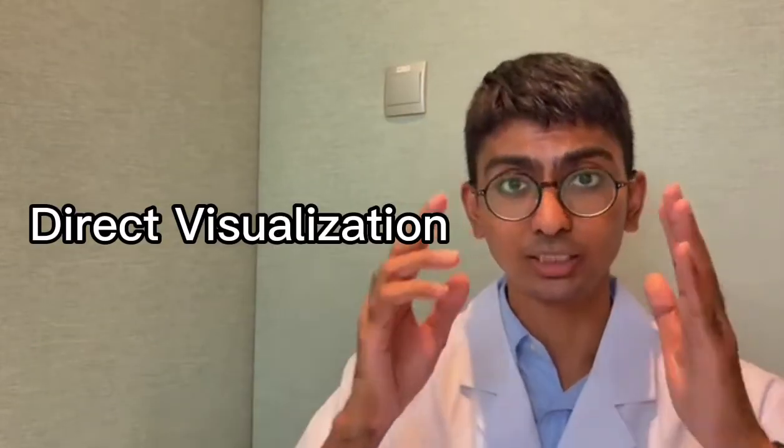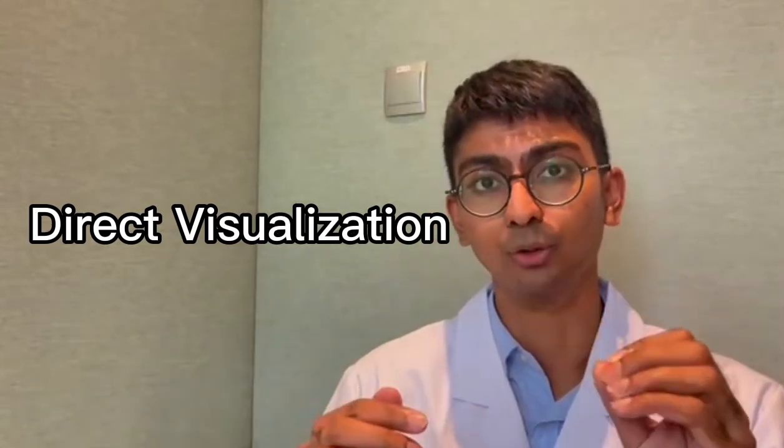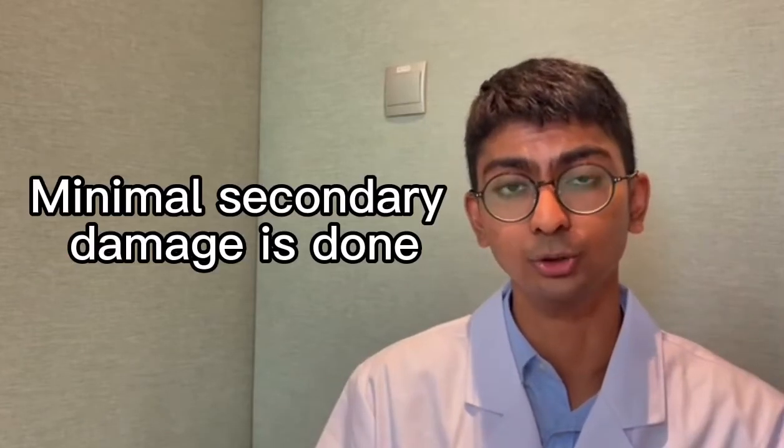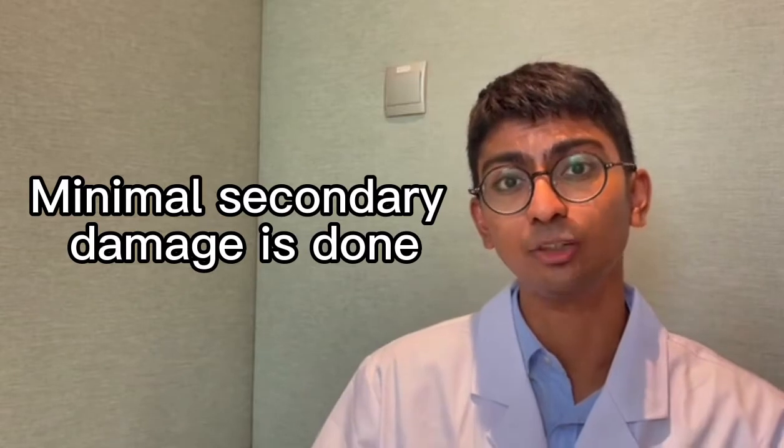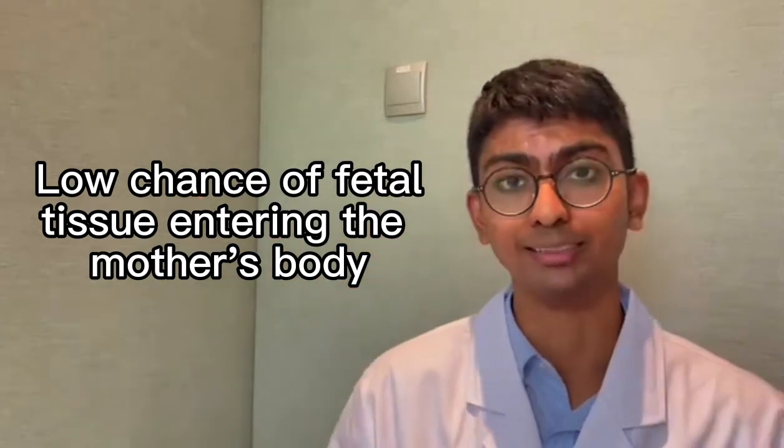This means the surgeon has direct and clear view of the fetus or the embryo that he wants to acquire and remove. So he can carefully use the tools that he has provided with his hysteroscope, for example, clippers and scissors, to accurately and completely remove the fetal tissues without causing any harm or any damages to the mother's uterus. So this significantly lowers the chances of any potential fetal tissue going into the mother's body, affecting her future pregnancies.